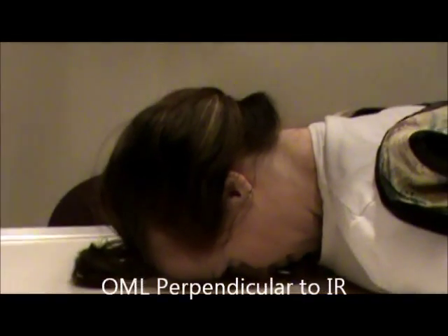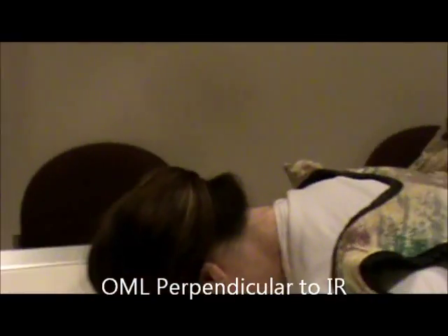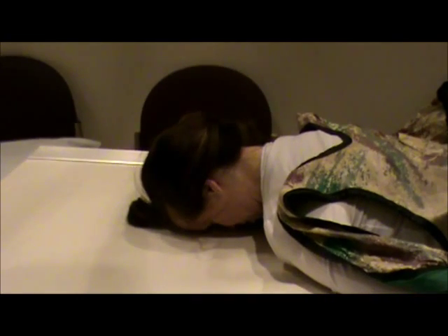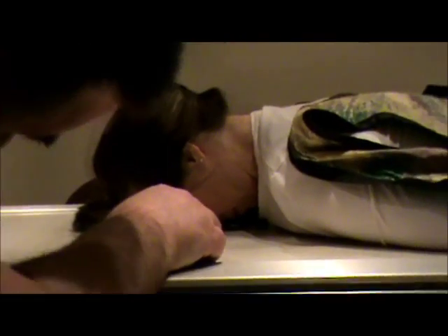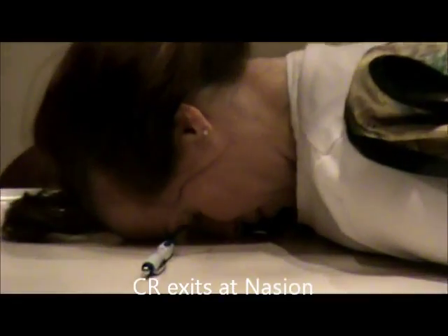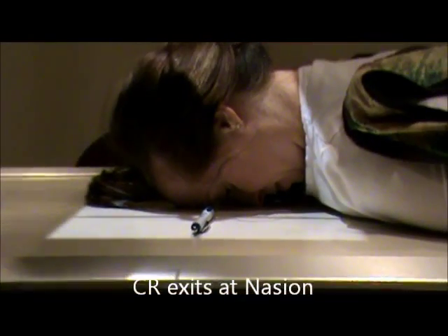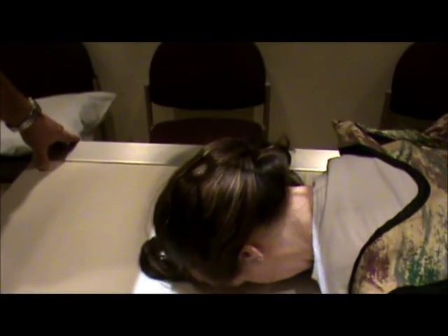Have the patient put their forehead on the table. I'm just going to verify and judge that her head is straight on the table. Then we're going to have the OML perpendicular to the IR — the orbital line should be perpendicular. We're going to get an ink pen and place it, since the ray should exit at the nasion. I'm going to center at the level of the nasion, so my collimation should enter at the pen there, at the MSP.